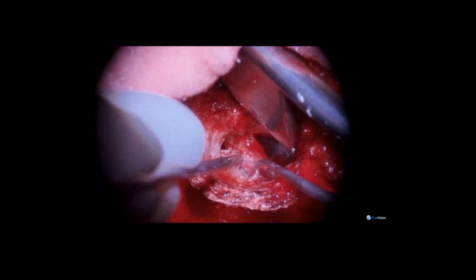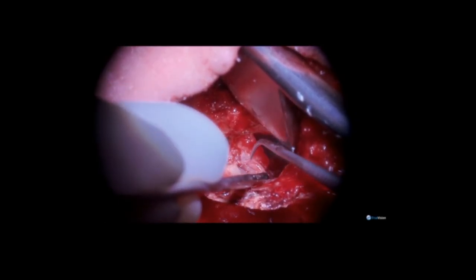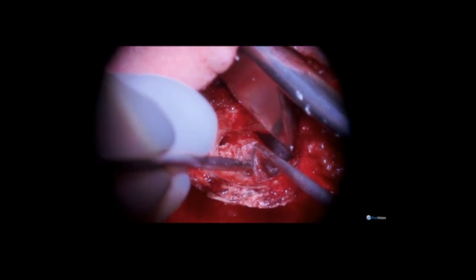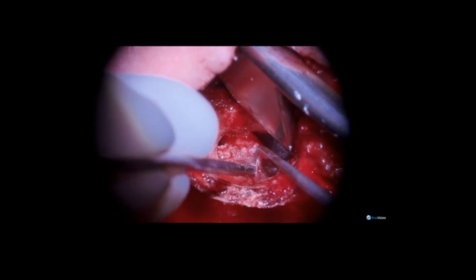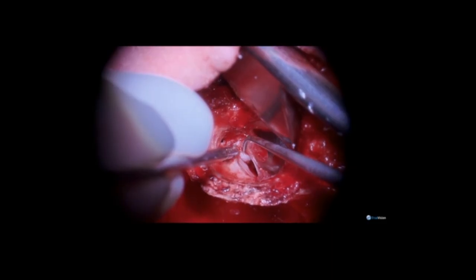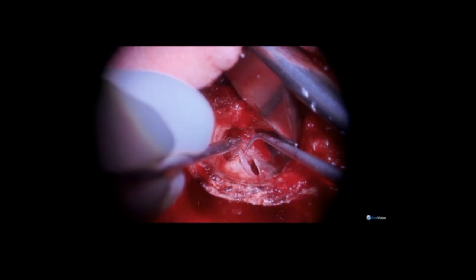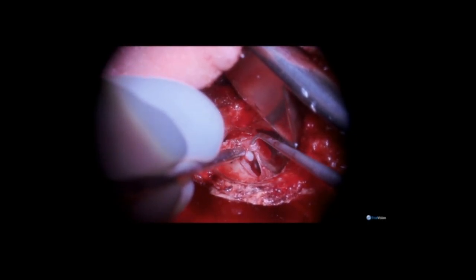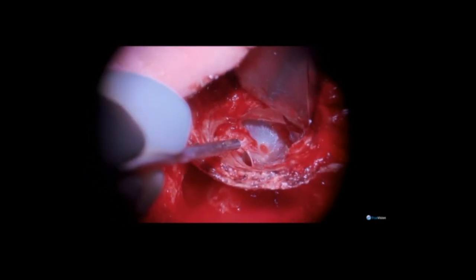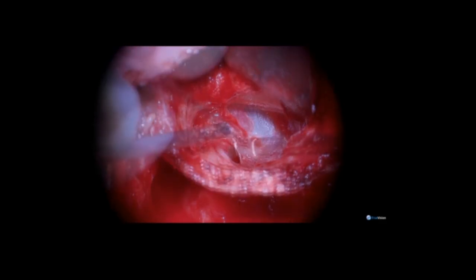You can see the neck of the cholesteatoma has been exposed, and now I am elevating the posterior superior annular ligament to get good wide access to the middle ear and also to incise the chorda tympani nerve, which must be removed because it is enveloped in cholesteatoma. You can see that cholesteatoma has involved a portion of the undersurface of the tympanic membrane, and I will excise and remove this segment to ensure the minimal chance of recurrence.